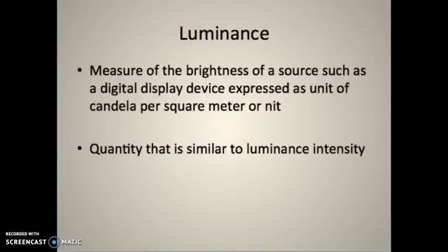So luminance is the measure of brightness of a source such as a digital display device, expressed in units of candela per square meter, or nit. So we say candela per square meter is your luminance. The quantity is similar to luminous intensity, so that's how bright the light is also, so it's very similar.